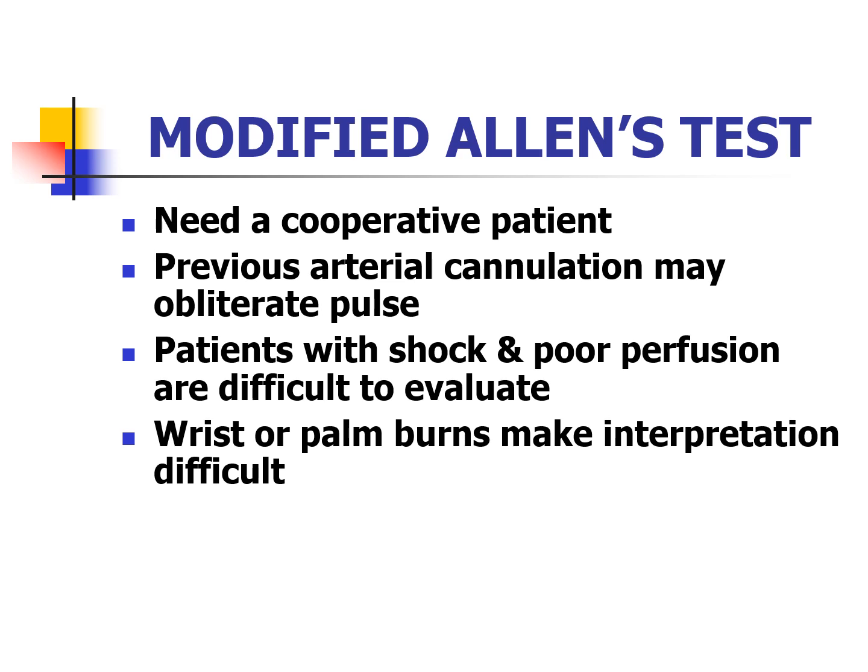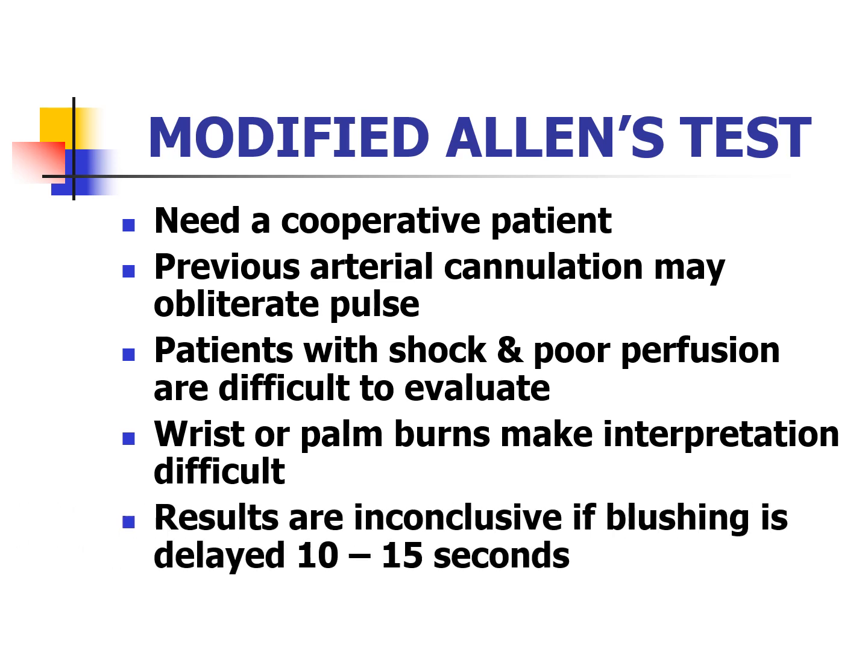That's why I would use the pulse ox too, because looking for color change is very subjective. From person to person it can be interpreted differently. But if I have a signal, I lose the signal, and the signal comes back again on the pulse ox itself, then I know I'm usually doing pretty good. That's why I always did my pulse ox version of the modified Allen's test. So, little trick, if you want to use it, go for it.